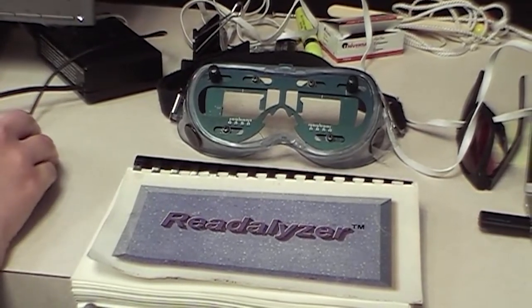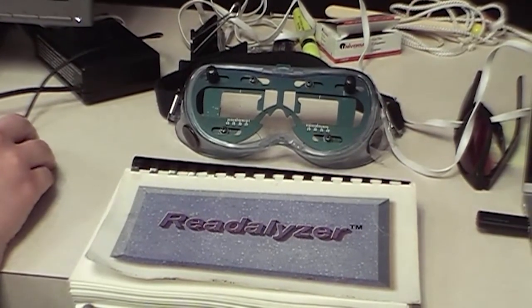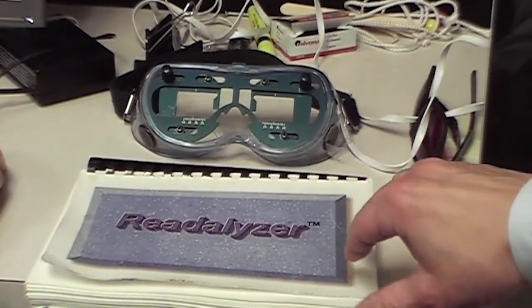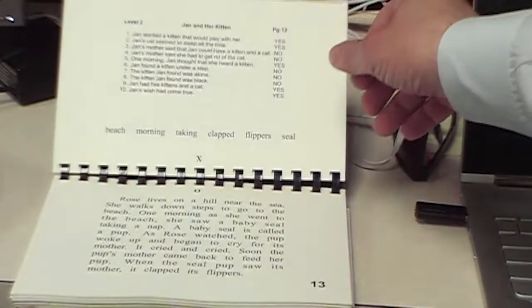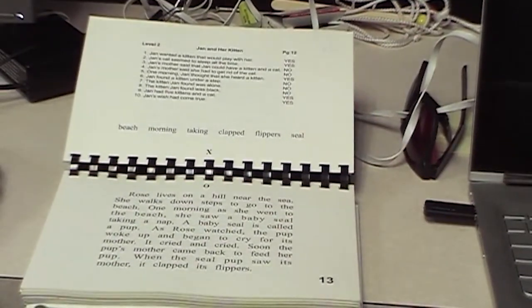You can see the ReadAlyzer manual. So this is on each grade level. So there's a reading passage that's on a first grade level, on a second grade, third grade, etc. And at the end of the test, what the person is going to be doing is answering 10 yes or no questions after they've read this.